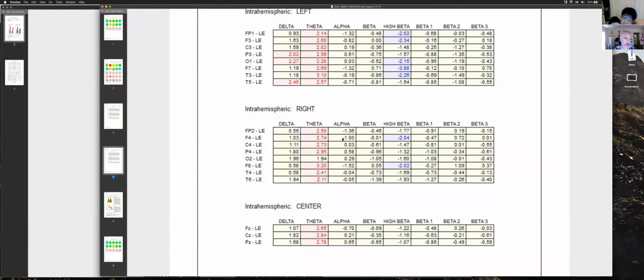So that tells me three things. One, you're built fast, very fast. People with this fast brain, up to 2/3 or a full standard deviation, probably faster than average, generally are highly intelligent and prone to anxiety. So good job. You have plenty of resources with which to catastrophize and stress. Your brain's that good.